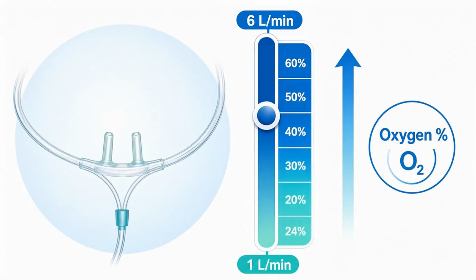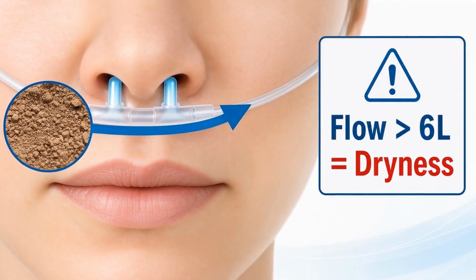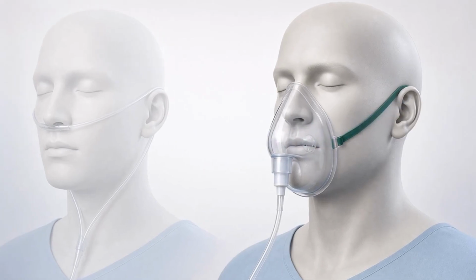On the NCLEX, keep in mind that increasing the liter flow increases the concentration, but keep it within the safe range. Be aware that flow rates exceeding 6 liters per minute can dry out the nasal passages, causing discomfort for the patient. Next, we move to the simple face mask.